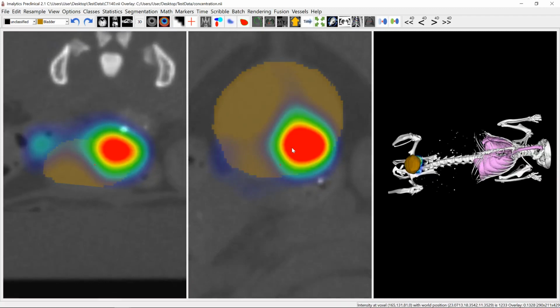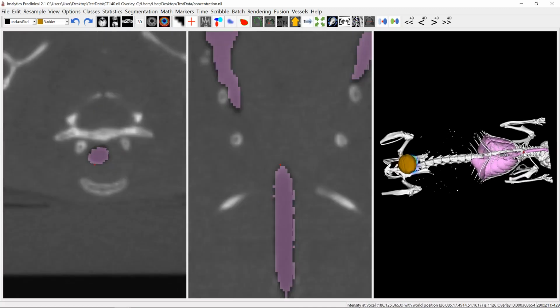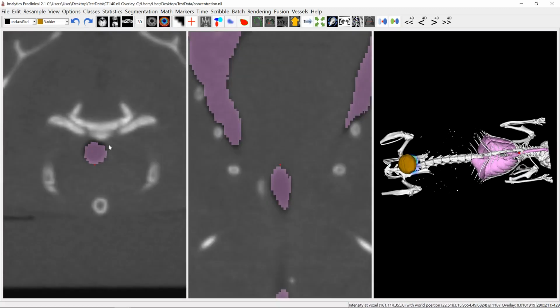There is one more interesting thing. The scribbles can be used for cutting. Let's go to the trachea here, for example. So I just jump there. You can use also this button to jump there. And so this trachea here is now connected to the lung, and if you want to remove it, you can draw scribbles around it here and press F2, and that is cutting the trachea.